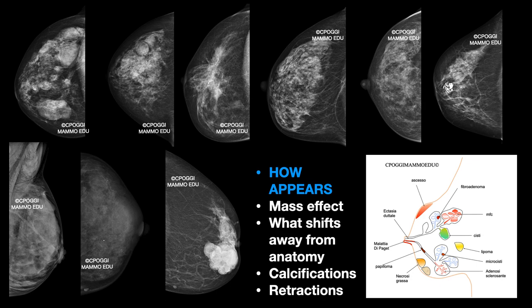There are often benign changes — most of the time appearing, for example, as density, even very large but well circumscribed, as distortion of the glandular profile, as density not generally present in normal anatomy. They may present as secretion, calcifications, as ectopic gland, swelling, or with a mass effect — such as to induce, as in this case, a retraction of the nipple.